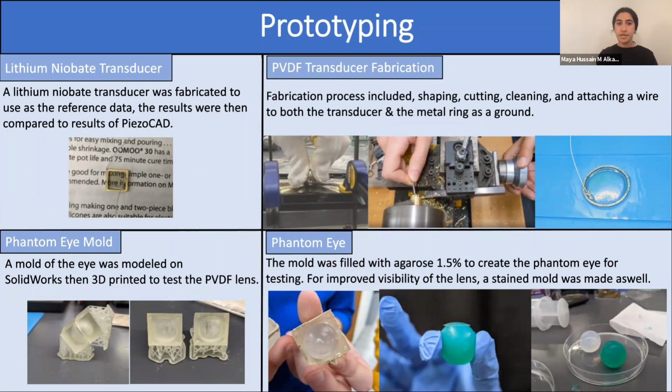Our first lithium niobate transducer was used as both a practice and a reference transducer. We used this lithium niobate transducer as we were familiar with the characterization and compared it to the PiezoCAD results to conclude that PiezoCAD did in fact deliver accurate characterization data, meaning that the PiezoCAD data of the PVDF would deliver very similar to real-life characterization experimentation results.